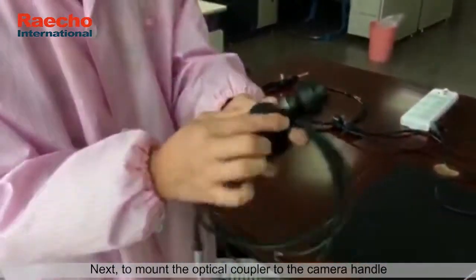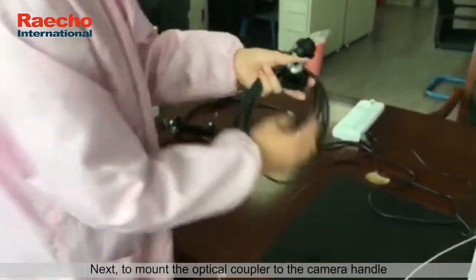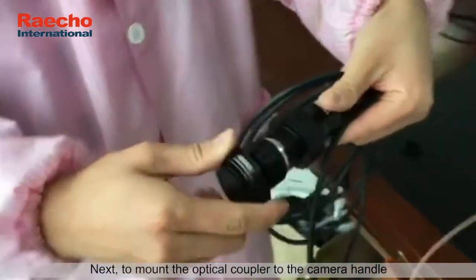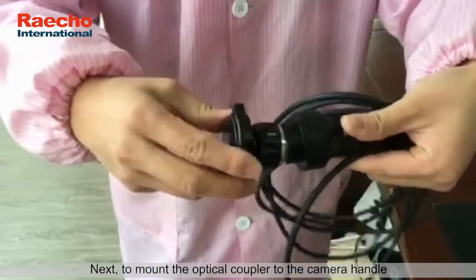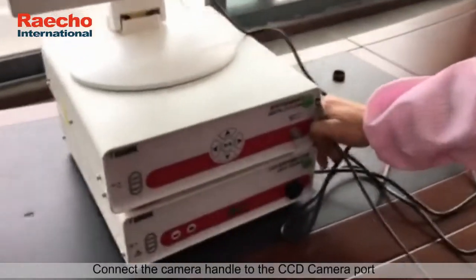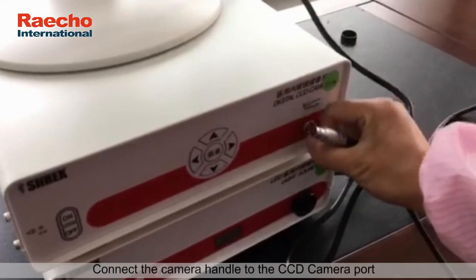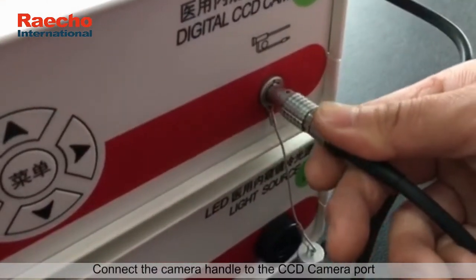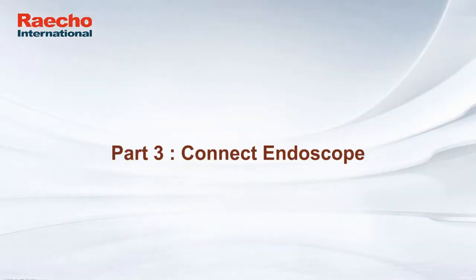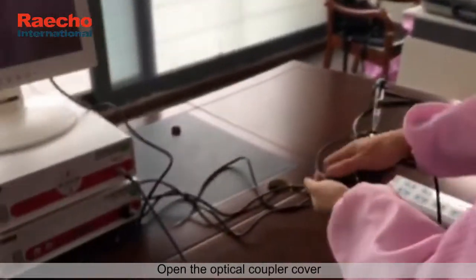Next, mount the optical coupler to the camera handle. Then connect the camera handle to the CCD camera port. Part 3: connect endoscope. Open the optical coupler cover.